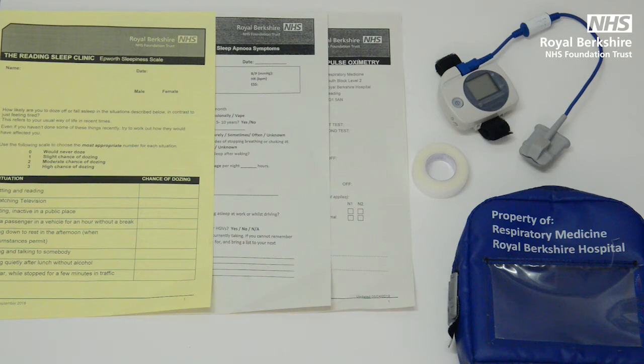You are required to carry out a two night sleep study to monitor your oxygen levels and heart rate whilst you are asleep. This gives us an indication as to whether you have a condition called sleep apnea.